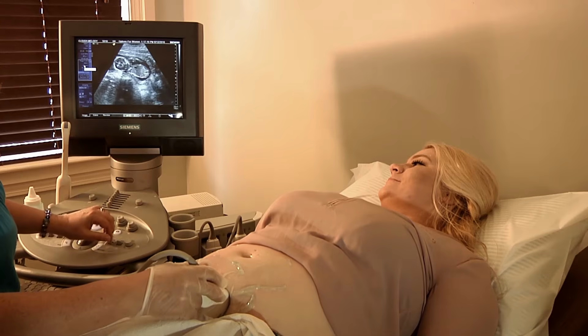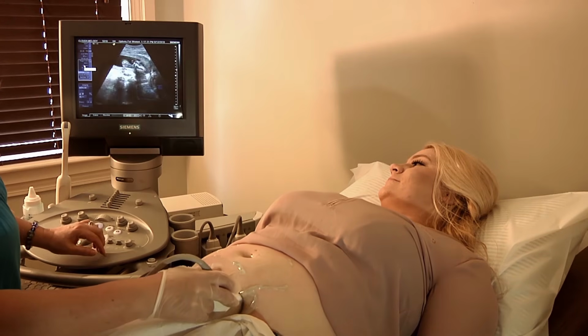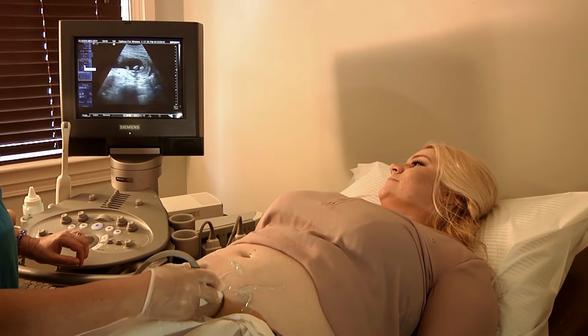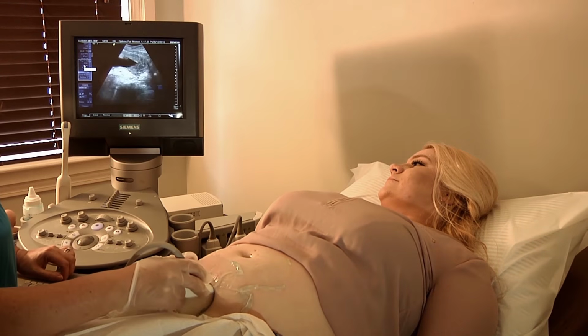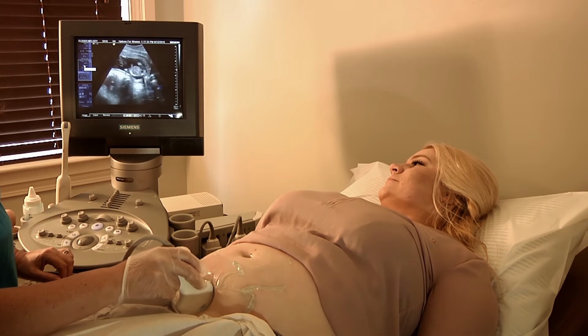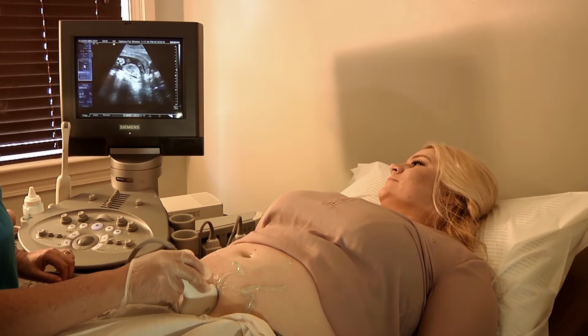So I'm gonna do my sweep. So I'm gonna make this a little smaller. She's sweeping to the right, and now she's, wait. Oh, look what I saw. That was umbilical cord. Going all around.